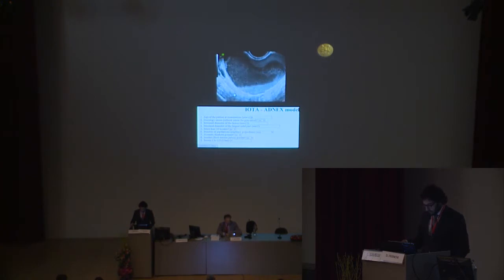As you see, the content of the cyst is not included in the features of the ADNEX model. And I put in the clinical features: the patient is 36 years old, it was not an oncology center. Maximum diameter of the lesion, you have seen, 75 millimeters.